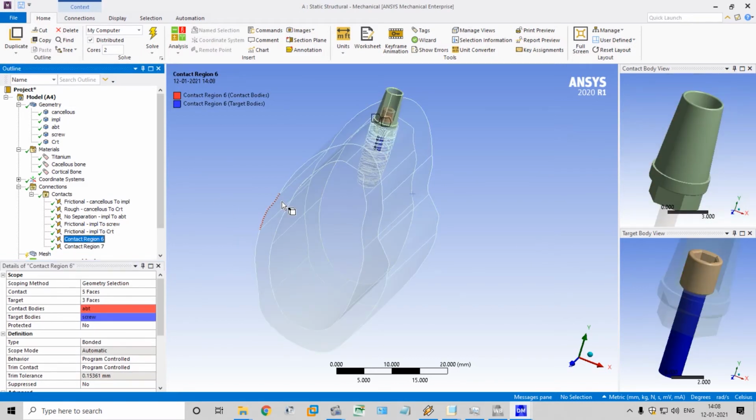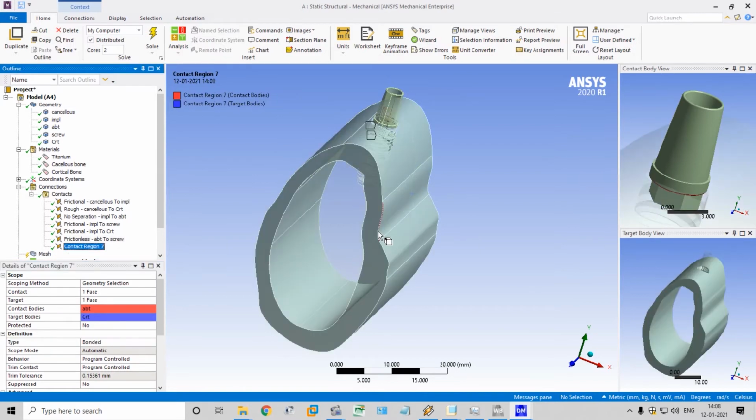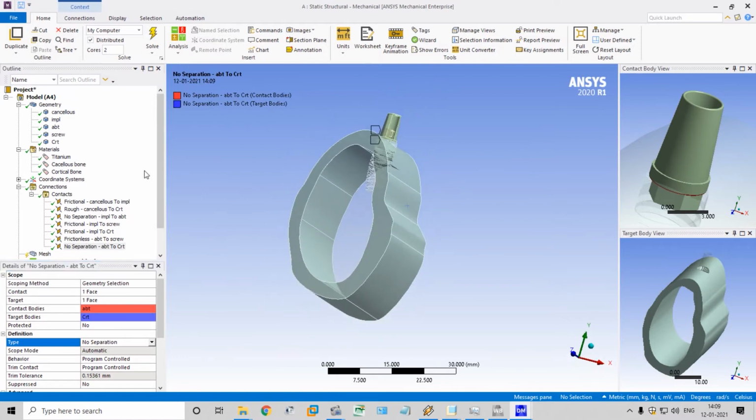Contact region between abutment and the screw, not bonded. Friction. When we completely tighten the abutment screw, no separation will be there. No, frictionless we can give it. Contact region between the abutment and the cortical bone: no separation. Okay, that's all. Contact is over.